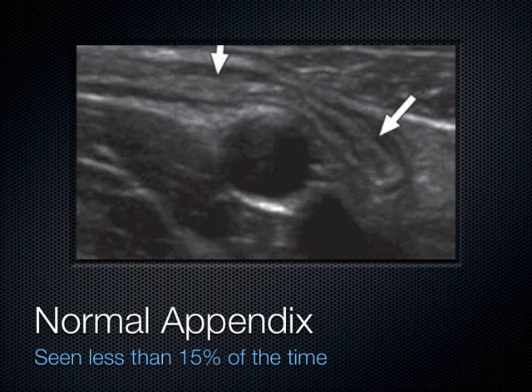This is an 18-year-old woman who had lower abdominal pain. We can see here this tubular blind-ended structure. Nice thin walls, certainly less than 5 millimeters, down there, right adjacent to her external iliac artery seen right here.